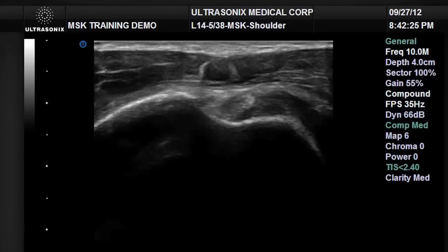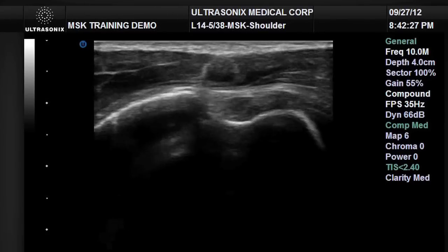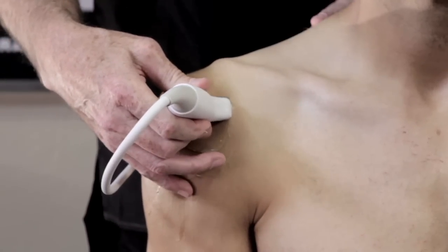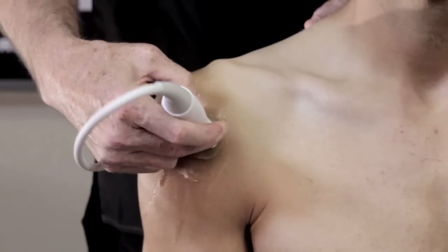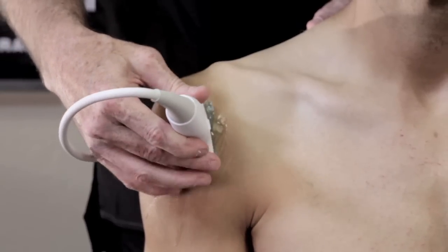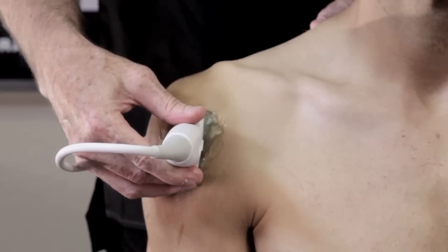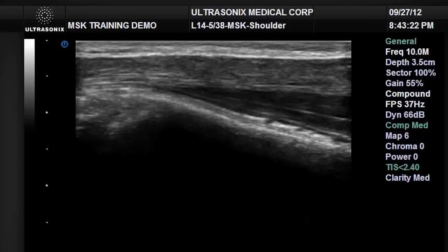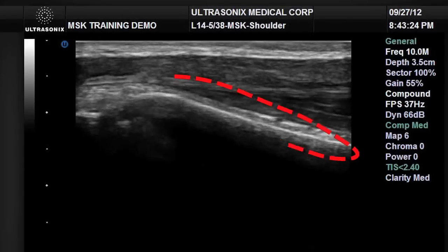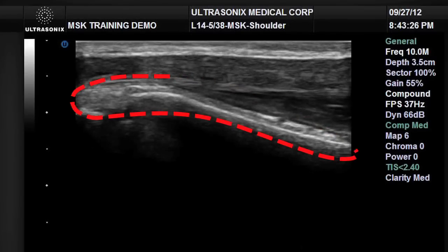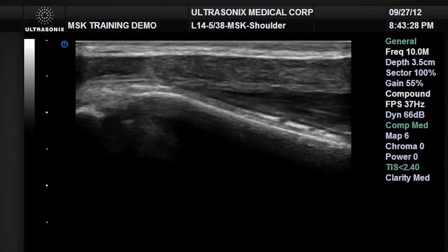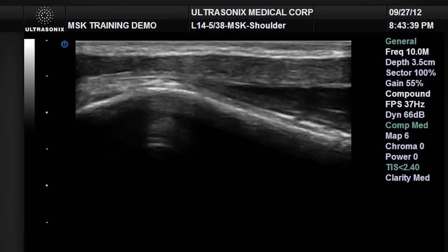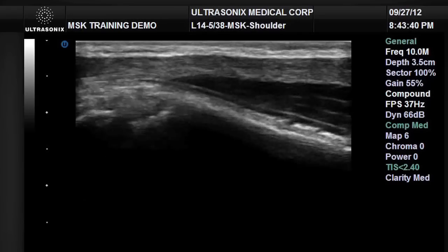After obtaining the short axis view of the biceps tendon, we'll place the probe in the short axis orientation, find the original view, and spin the probe 90 degrees into longitudinal orientation. We will then elongate the cortical margin of the humerus — the bright, thicker line at the bottom of the image — all the way across the image, and from this point translate the probe medially to bring it over the bicipital groove to visualize the biceps tendon fibers.